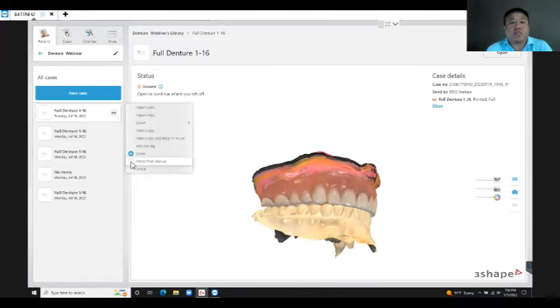You can also use this protect from cleanup with other cases, like for crowns. There's one doctor that called me and asked why the laboratory couldn't see the scan, but they could see a picture. That means that they didn't post process it, and also they didn't protect from cleanup, so they didn't submit it right away.